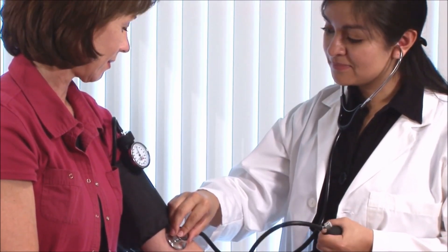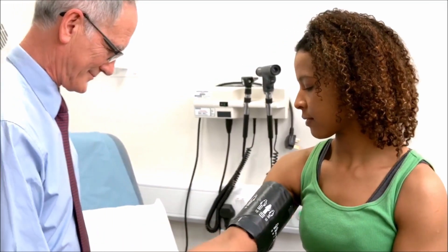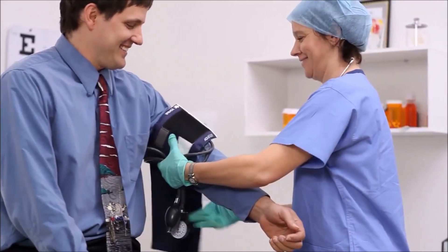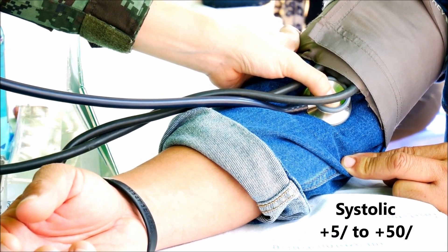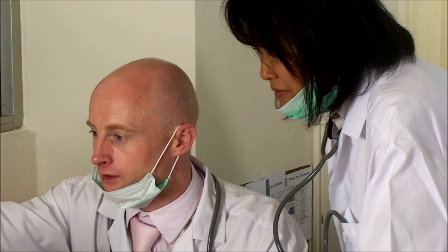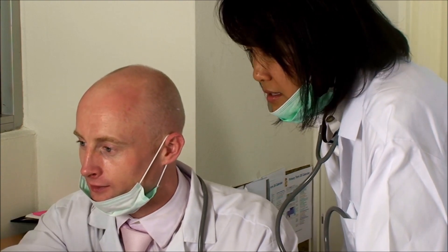Another study researched over 2 million past blood pressure measurements to examine them for accuracy. They noted that one of the errors was measuring blood pressure over clothing, and that it could raise systolic blood pressure by as much as 5 to 50 points higher.